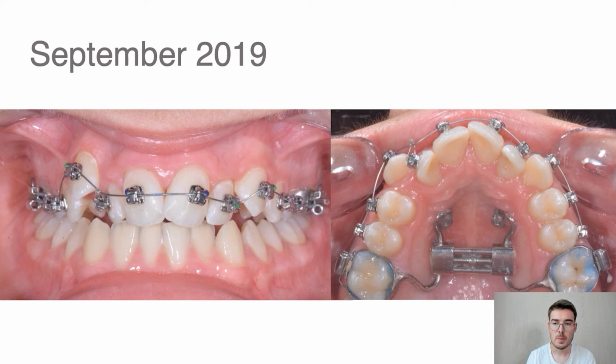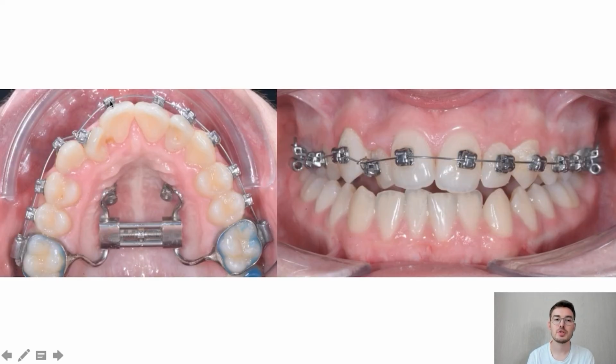Passive self-ligation allows this. I use round soft arches. You can see that I carefully tie the arch to the tooth and then insert it into the groove and let the patient go home to give his periodontal some time to adjust, so that we can achieve the maximum results. See, the screw is completely untwisted.